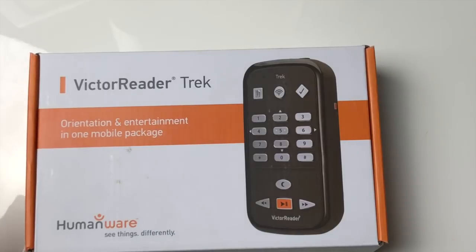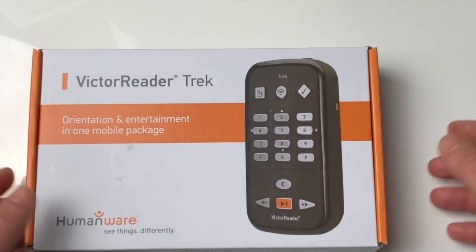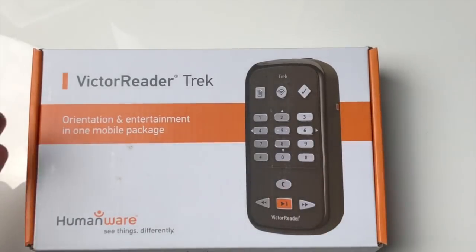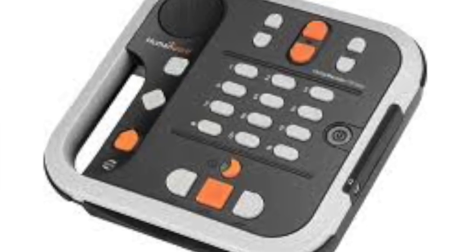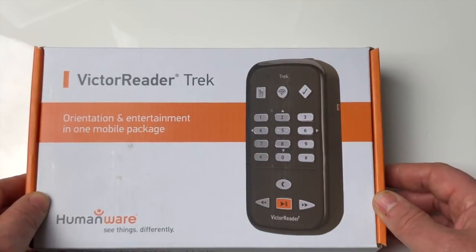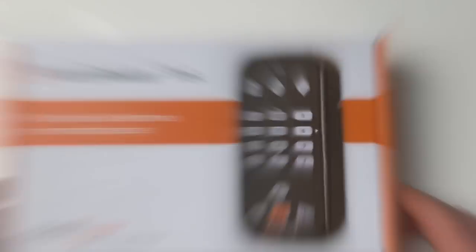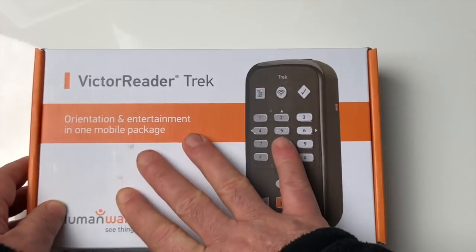On avait donc de la part de la société Humanware, une société canadienne, la possibilité d'avoir le Victor Reader Stream. On a eu le Victor Reader, on a eu le Victor Reader Stratus. Aujourd'hui ils ont amélioré leur gamme avec un outil qui va pouvoir guider les gens aussi bien en mode piéton qu'en mode voiture : le Victor Reader Trek.